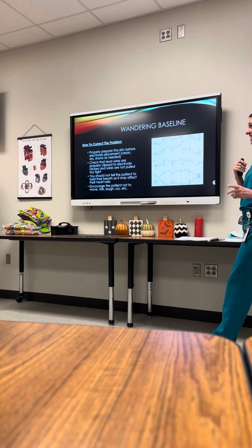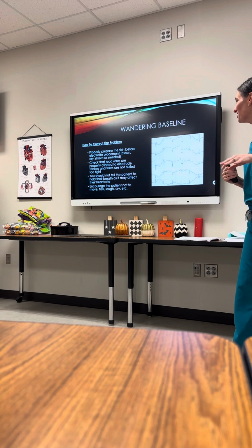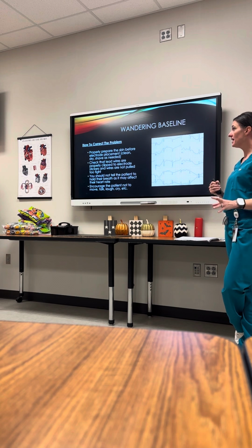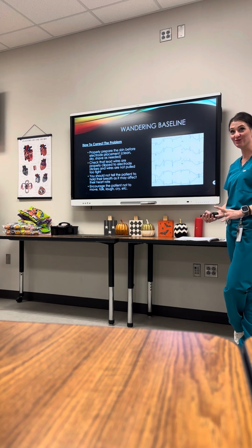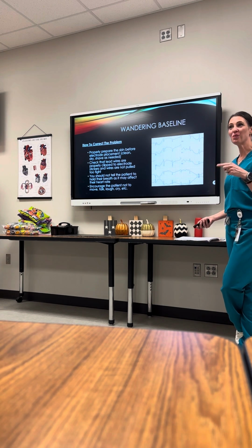We should never tell a patient to hold their breath. You will get questions about this. Never tell your patient to hold their breath. It could change their heart rate. And encourage our patient to be as still as possible. We don't want them moving, talking, laughing, crying. They need to be as still as possible. That's how we're going to correct wandering baseline.